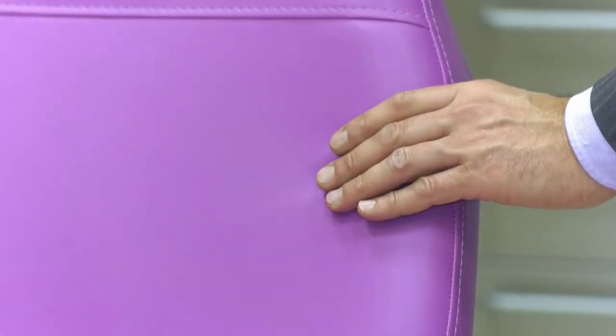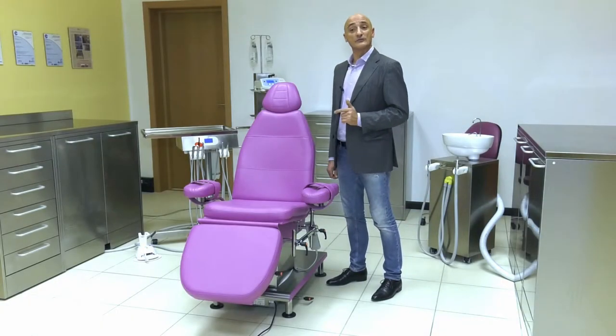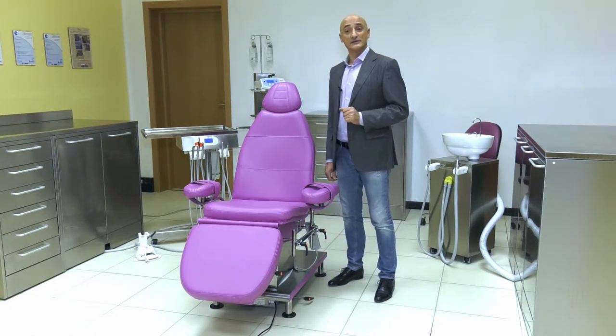As you can see, the padding is 5cm high — less padding would not guarantee comfortable seating. Click below to see the colours and certification.